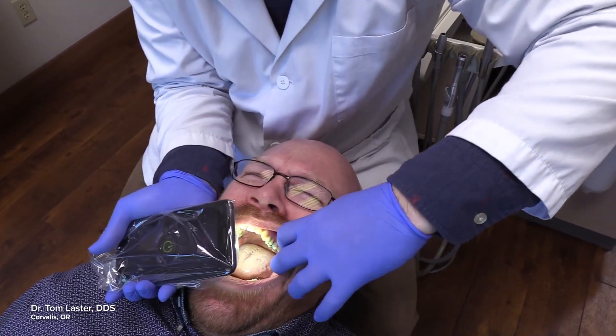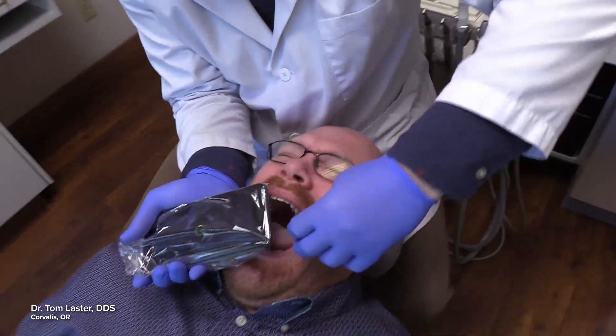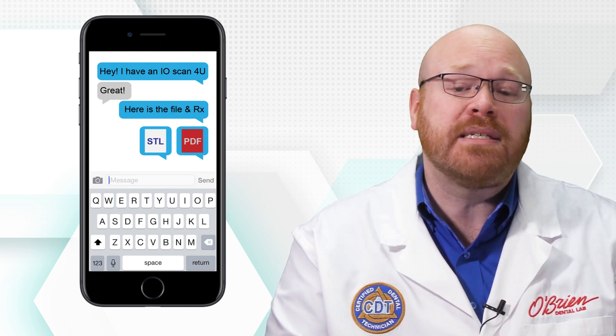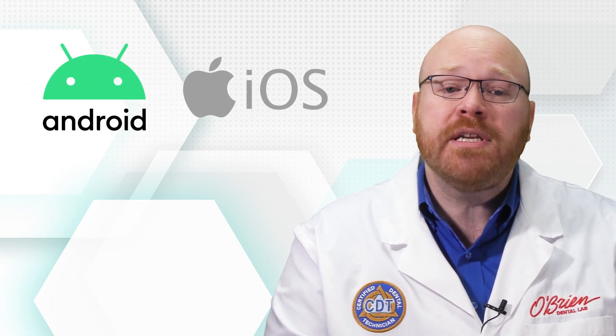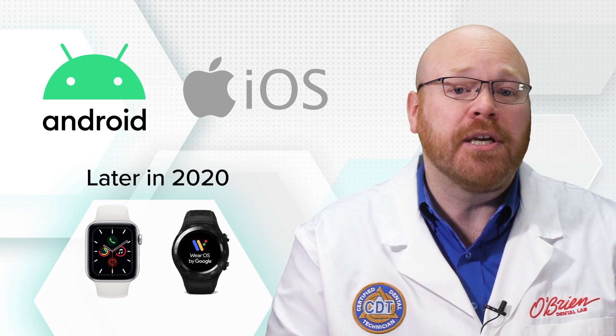Make sure to rotate the phone's camera around the tooth to capture the entire margin. Patients with a strong gag reflex will especially appreciate this pain-free alternative to traditional impressions. Sending the case to the lab couldn't be easier, as the files can be sent through text or any other messaging service. The app is available for both Apple and Android devices, and integration with Apple Watch and Google Wear is coming later this year.